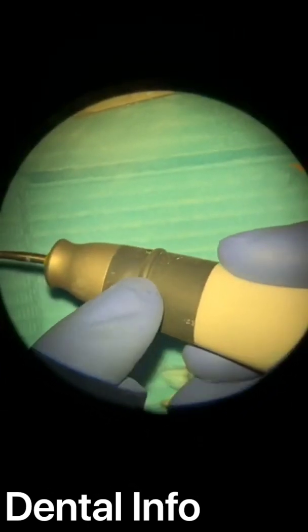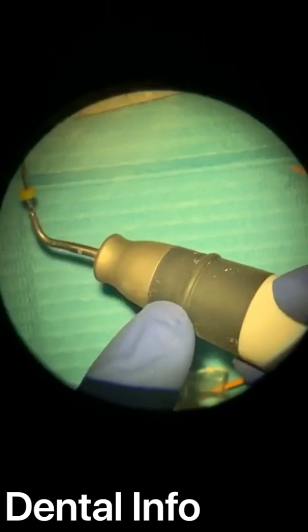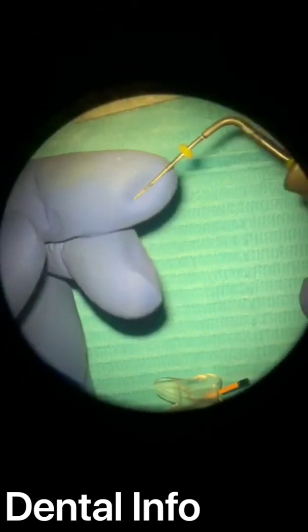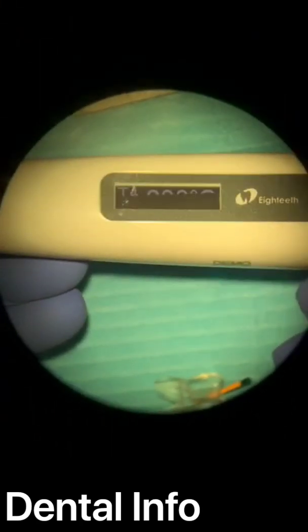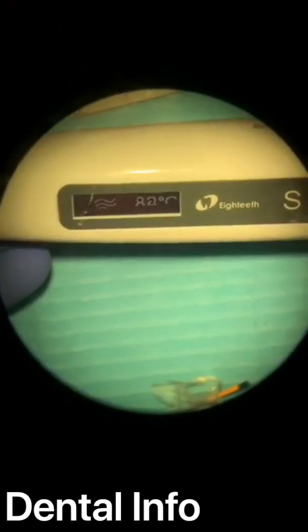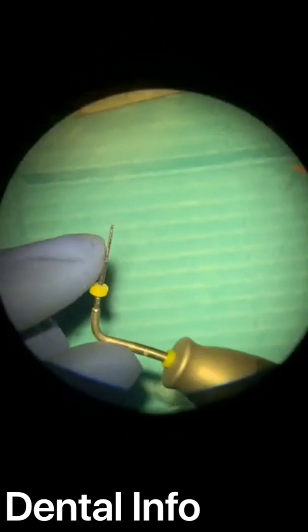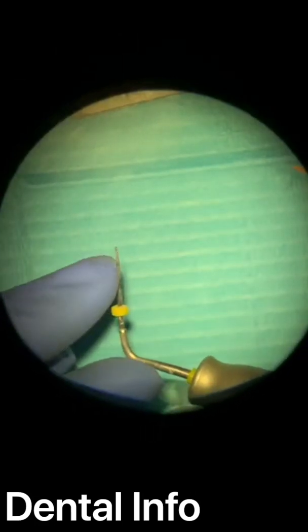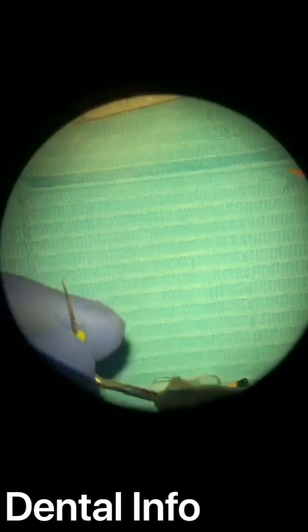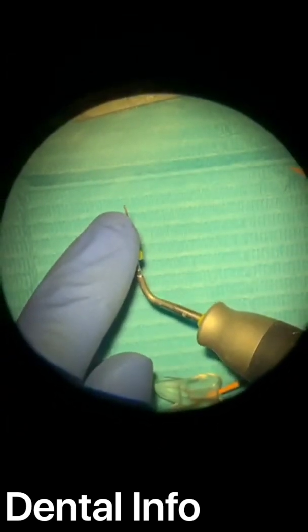If you are pressing here, here, here, all do the same function, you will activate the tip, and the tip will increase the temperature very quickly. See, look here, when I'm pressing, in less than one second, the tip will be ready to cut with 200 degrees. Of course, the temperature here will not be 200, it's less, but we set it at 200 to make sure that we have enough temperature here to cut.